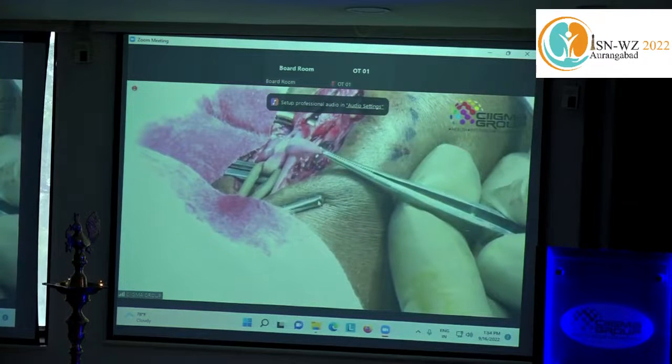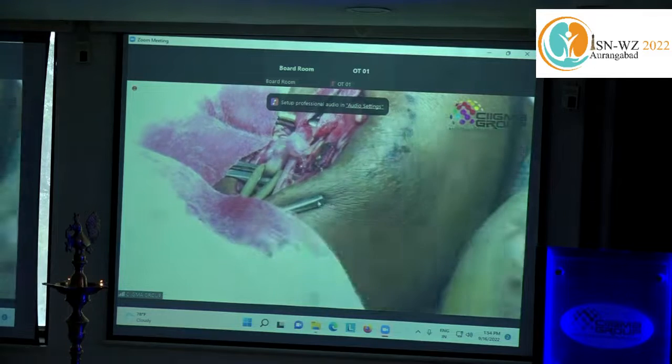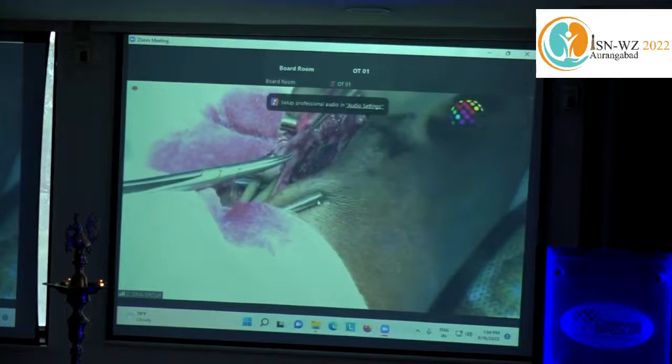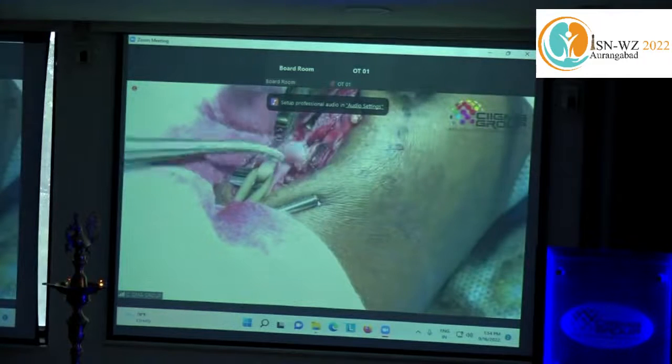This is it, I am done with it. Okay, so I am done on this side. I think this technique will definitely help you, and I am short of time actually. So we will do it within 5 minutes.